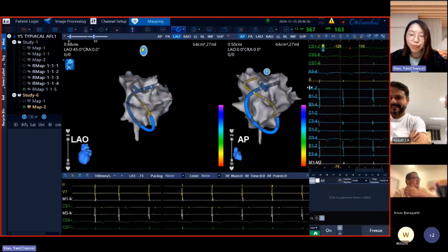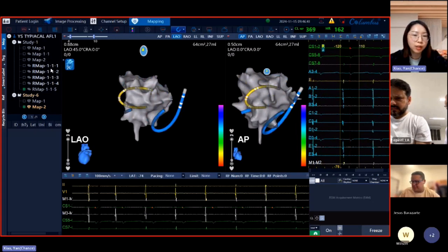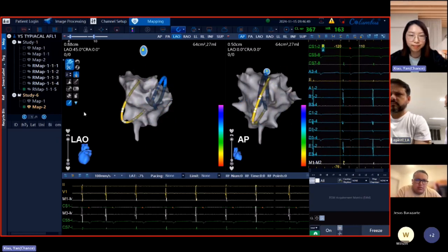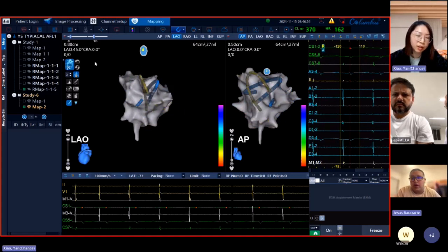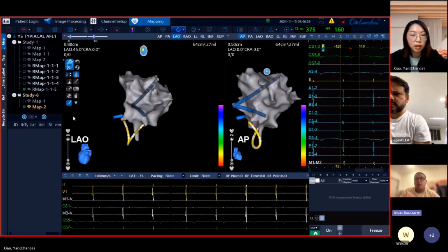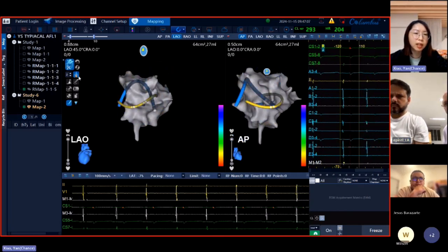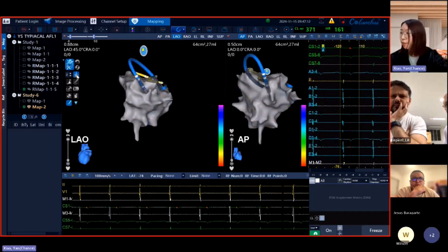And also here, I would share one point on the previous version with Rodrigo. Once you use the V4.002, do you commonly use the respiration compensation in your cases? Yes, we use it a lot, frankly speaking. Okay. If you use respiration compensation a lot, do you use the gating mode? Do you use this feature?